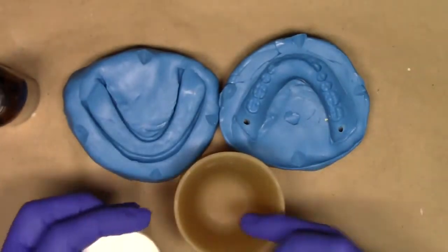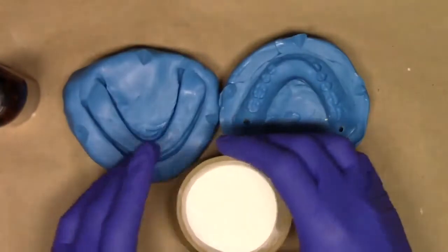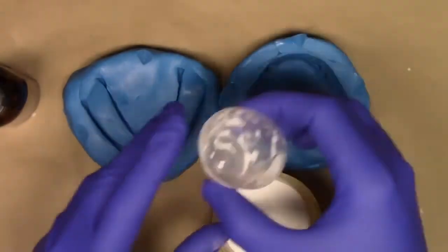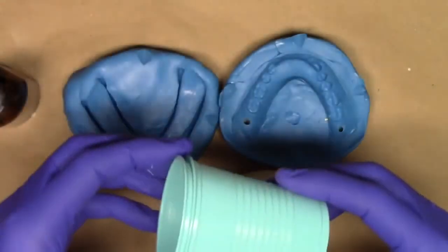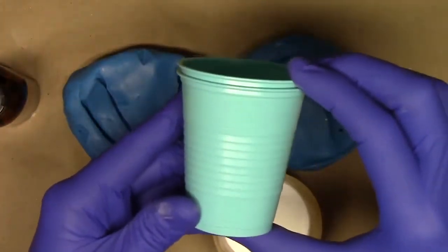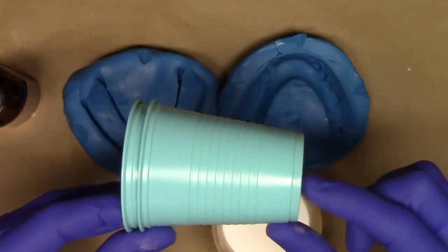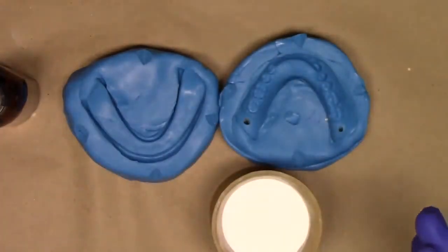I'm going to take my powder and dump it into this large dappen dish. This large dappen dish not everybody has in their office. I do, just because I do a lot of laboratory work. Alternatively, you can always mix directly within this plastic dappen dish, or if you take 2 cups, put them together and mix inside of here, it gives you just enough working time so that way you can pour this into our putty mold. Now do be careful because the monomer will eat at the plastic, so if you have a Dixie cup or paper cup, that's ideal.